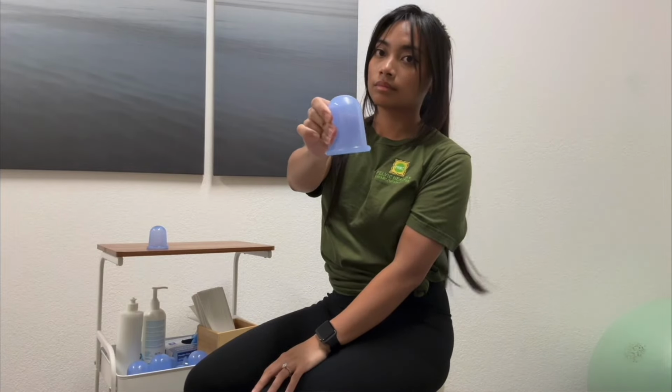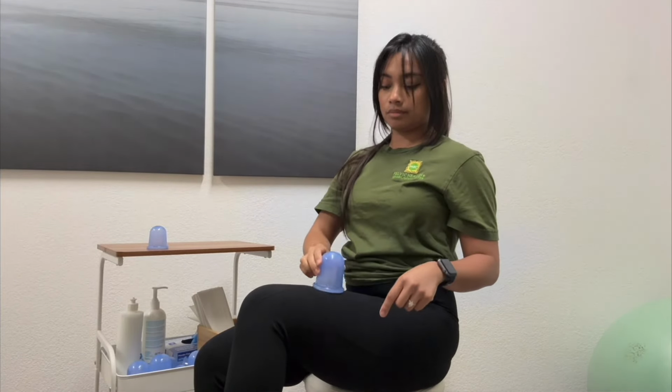Another option is statically with some movements. For example, I have a lot of patients who are busy or like to multitask and decrease time spent doing certain home exercise programs or modalities at home. I like to advise placing the cup on the desired body part and adding movement to it, because when we're moving, our muscles and fascial lines are also moving underneath those cups, and it makes it a little more dynamic.